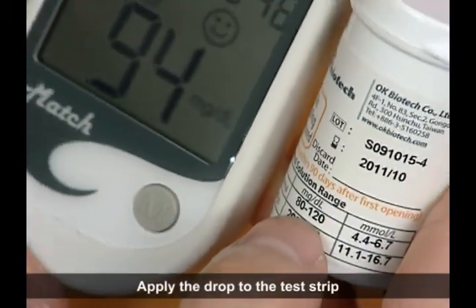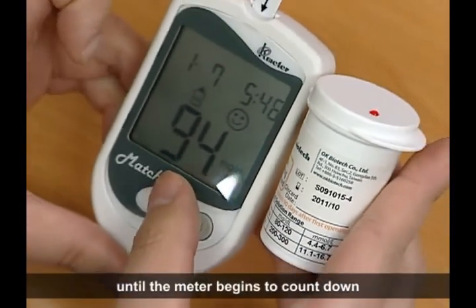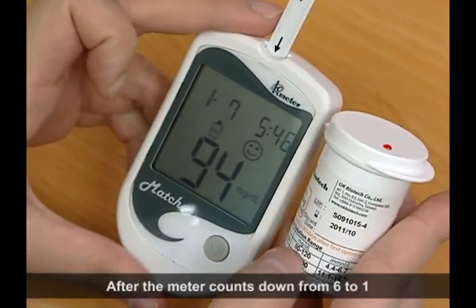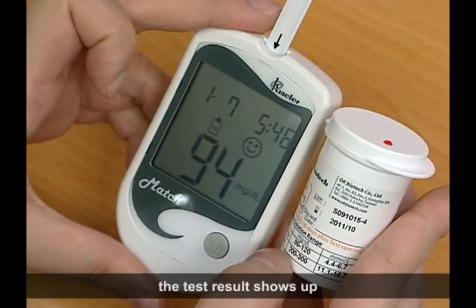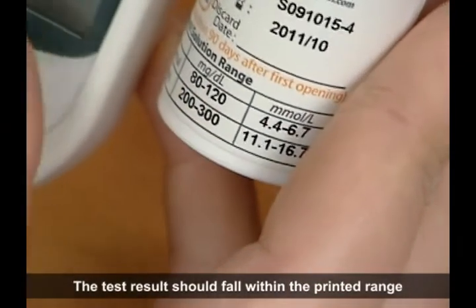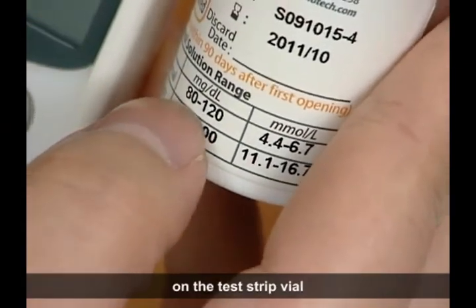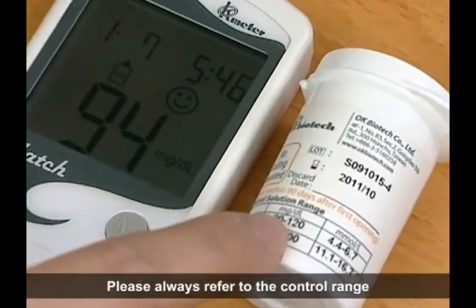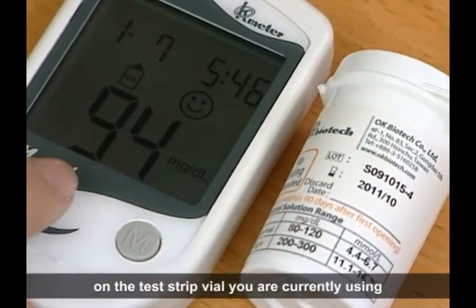Apply the drop to the test strip until the meter begins to count down. After the meter counts down from 6 to 1, the test result shows up. The test result should fall within the printed range on the test strip vial. Please always refer to the control range on the test strip vial you are currently using.